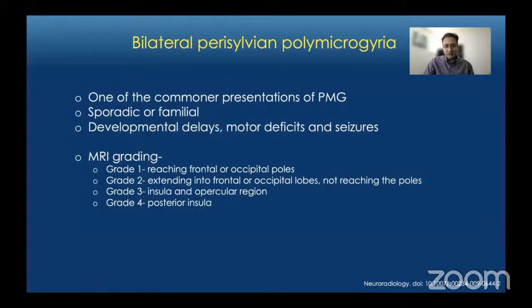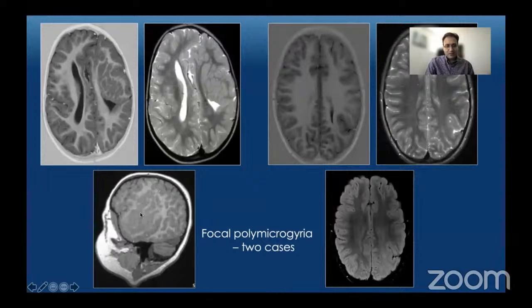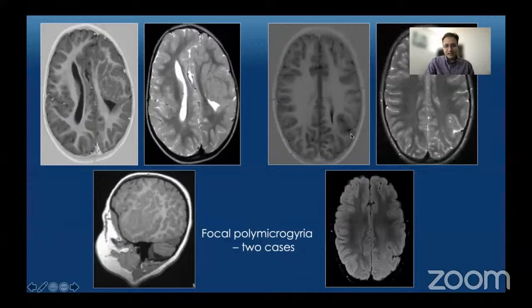These two cases show focal polymicrogyria. The patient on the left has an almost mass-like lesion in the left frontal lobe with multiple lobular areas of gray and white matter — this is complex nodular polymicrogyria, which can mimic a mass but follows gray matter signal on all sequences. The other example shows focal polymicrogyria in the left parietal lobe with an abnormally deep sulcus and thickened lobular cortex lining it. This can cause seizures and requires careful MRI evaluation.